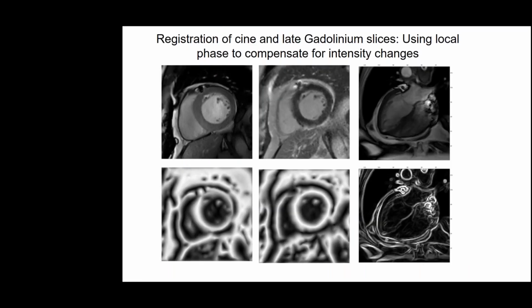Okay, now this will allow us to reconstruct the three-dimensional surfaces from the cine MRIs. But as I said before, with MRI, we can also get tissue composition and other things, right? So if we want to introduce here the possible presence of an infarcted area, say from these late gadolinium enhanced images that I mentioned before, we need to take the slices that we get from cine MRI and register them with the slices that we get from late gadolinium enhancement, right? And if we try to do that directly, it's difficult, because it's difficult to mathematically define when they are well aligned, because the images are too different.